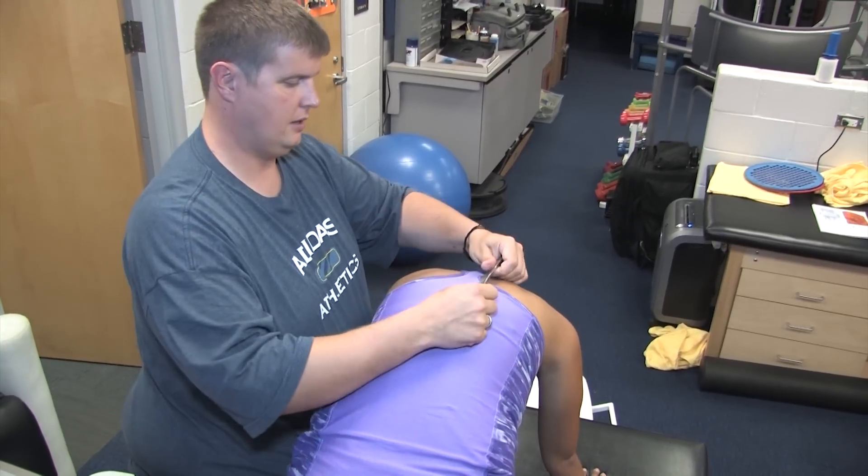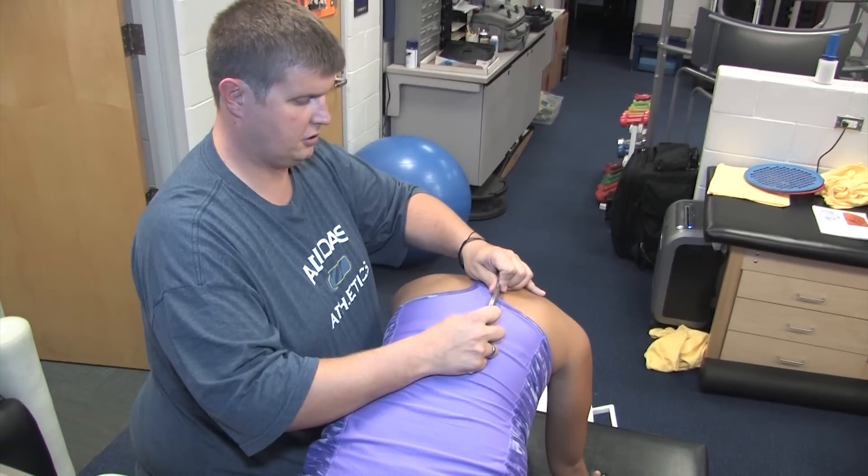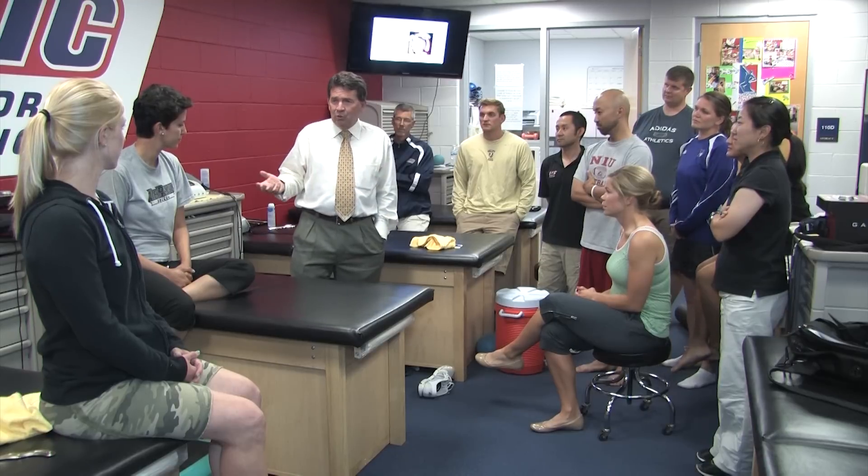As she rounds her back, we are going to continue to scoop. The fact that we bring in stretch, concentric loads, eccentric loads, and isometric loads — that is going to bring the restrictions to the surface much easier to find.